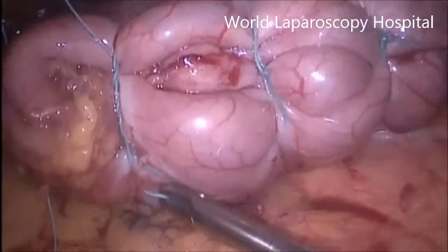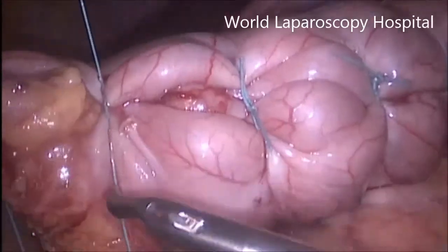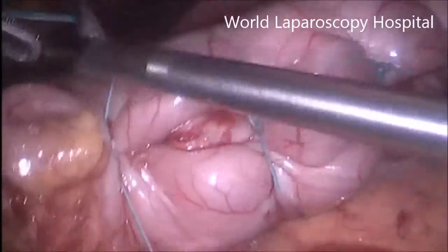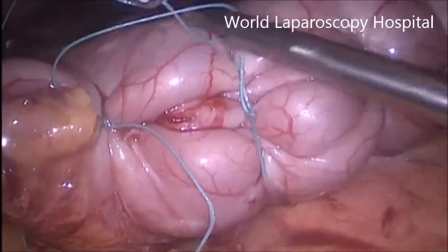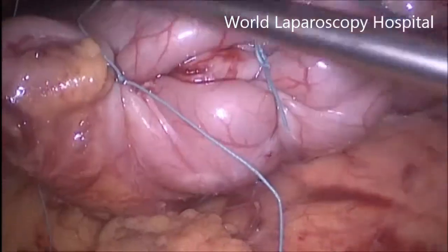Every time, the three wraps of the surgeon's knot will not give you slipping. When you are going for the other C or reverse C, at that time it will not slip out. Some people also use an extracorporeal knot.